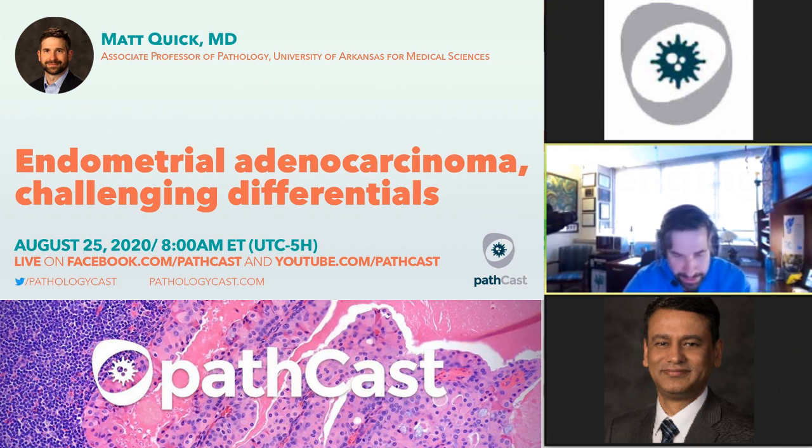Whenever I see a cervical biopsy with something that looks endometrioid or an endometrial biopsy with something that could be endocervical, I always want to make sure that I'm not dealing with the other site, right? Or the cervix to the endometrium. So this is a perfect example of that, and you've got to ask this question. I think the easiest thing to do is to go to the chart first, right? Because that's quick and it's free, and you can look.